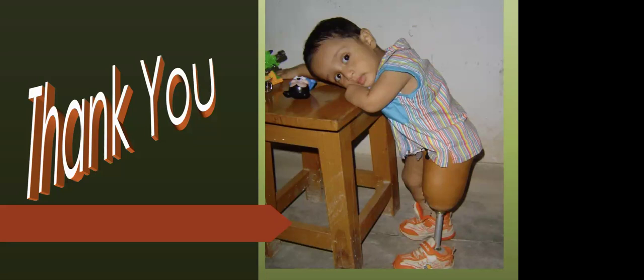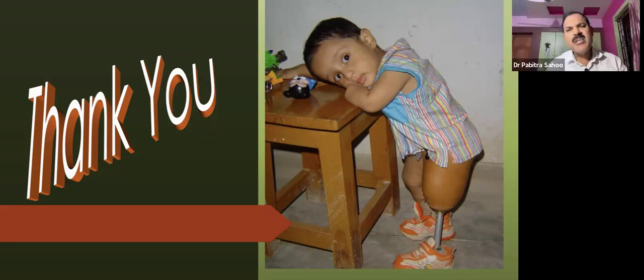Sir, what socket and suspension is preferred in a residual limb with grafted skin? For grafted skin, if there are sensitive areas, we have to give clearance in the stump. The suspension system has a limited role in that. The suspension's role is to keep the socket in place or in contact with the stump. So it has no direct role.